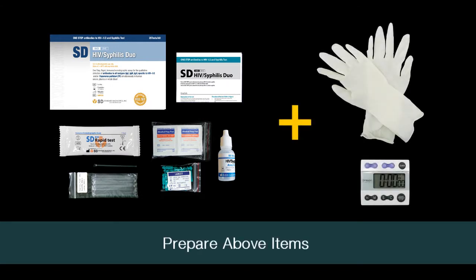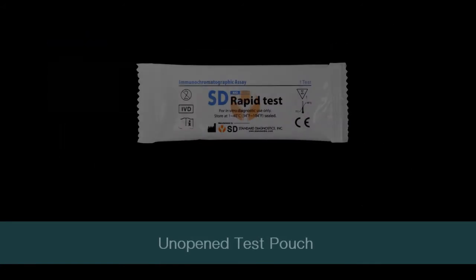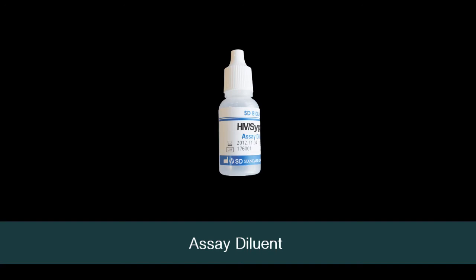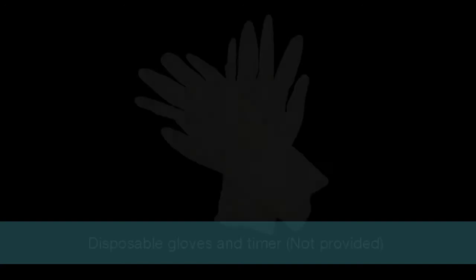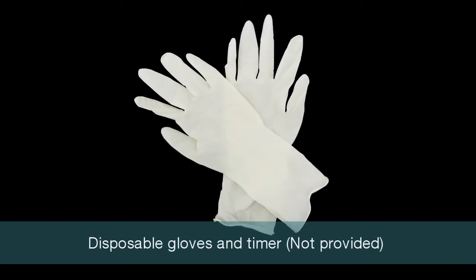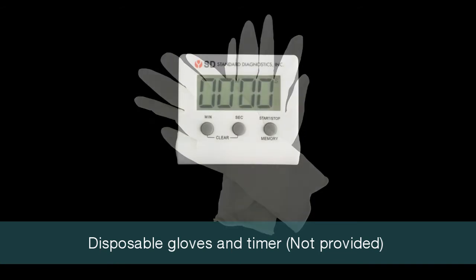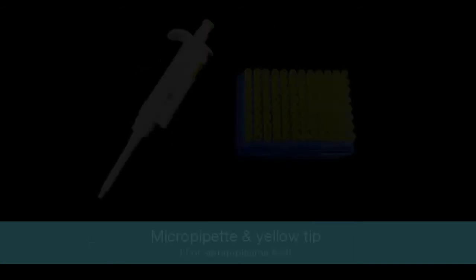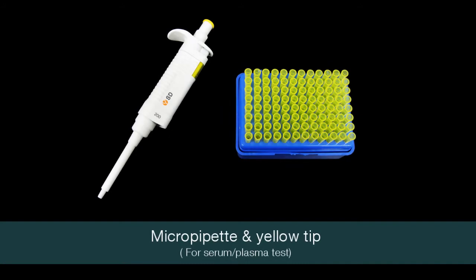These materials should be prepared before starting the test: an unopened test pouch, assay diluent. New disposable gloves and a timer are not provided but are necessary. For a serum or plasma test, a micropipette and yellow tip should also be prepared.